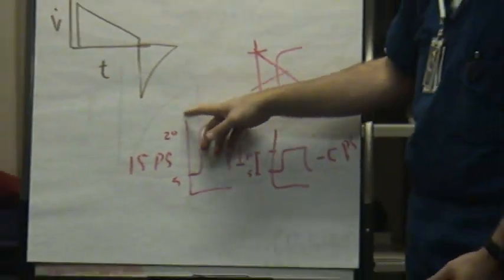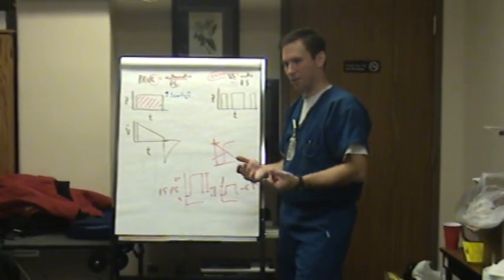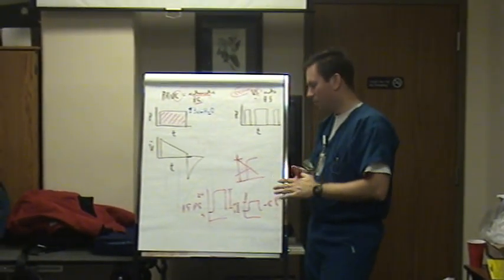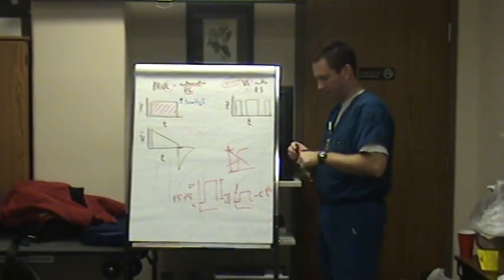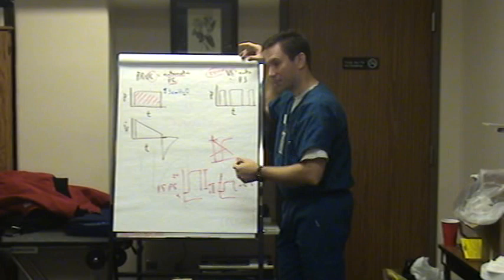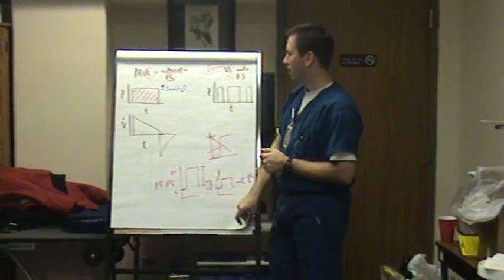If this peak is 35 and my PEEP is 5, well, I know if I extubate them, they're not going to fly. They're on 30 of pressure support or 25 of pressure support. Does that make sense? And the minimal amount of support that you want to see a patient getting is 5. Anything more than that, you're going to be working them out. But that's how you can look and see, is the vent doing the work or is the patient doing the work? So that's volume support in a nutshell.